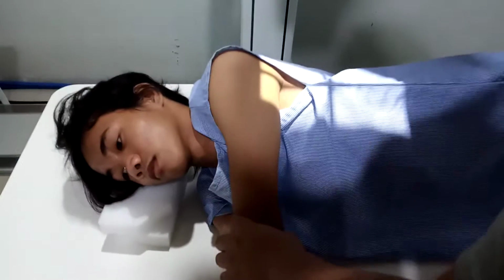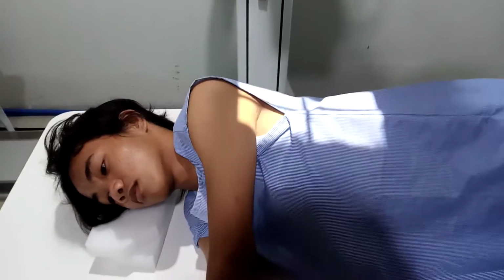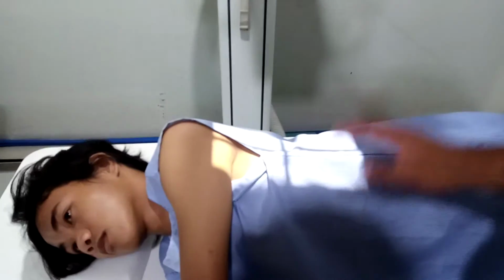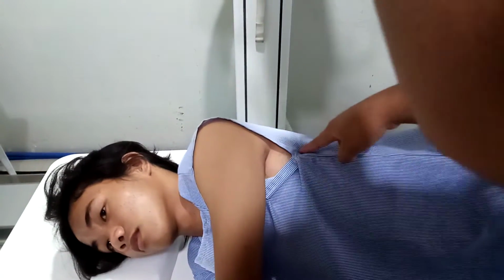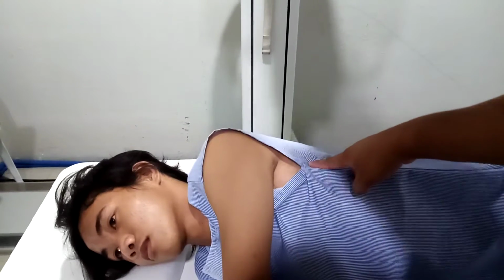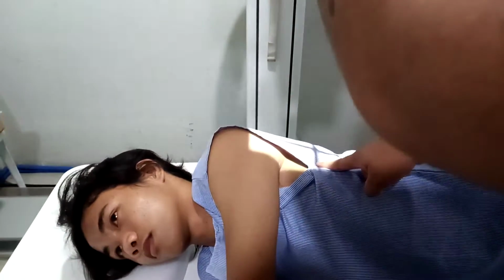So your thoracic 7 can be palpated at the inferior angle of your scapula. Okay, this is the inferior angle. So the central ray must be perpendicular to the IR.